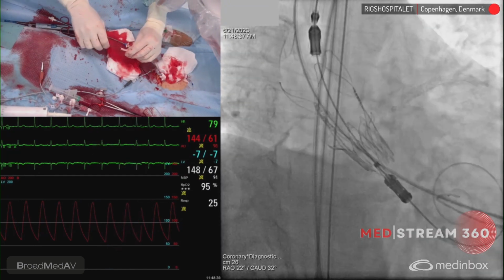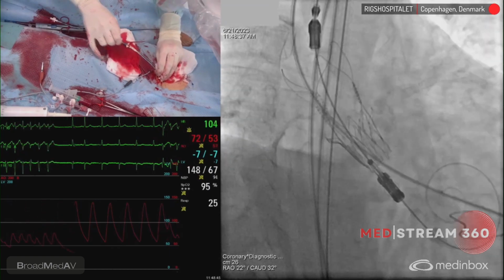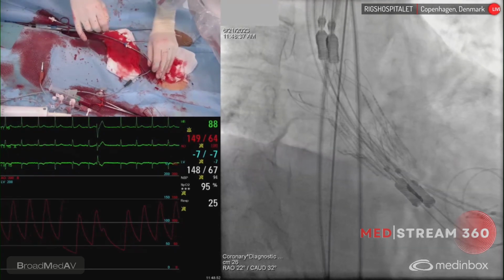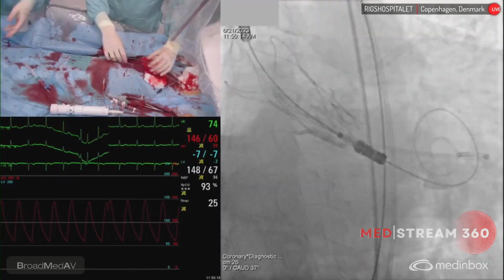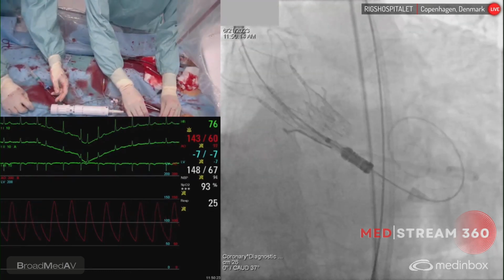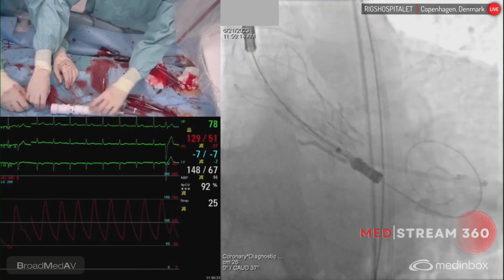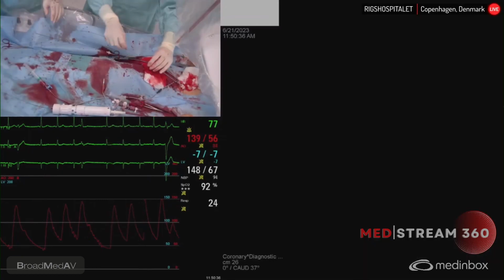Let me see if I can play. So we have to be able to push the catheter normally on the left side and then on the inside of the overlapping arch. I think it can almost not be that I'm in the center. All right, good. Then stiff wire, please. Yes. Wait, let me push. Can you hold the wire? I'm going to push it just a tiny bit lower. Just a bit away from my valve. Don't pull too much. Let it go a bit. Yeah, that's better. All right, good.